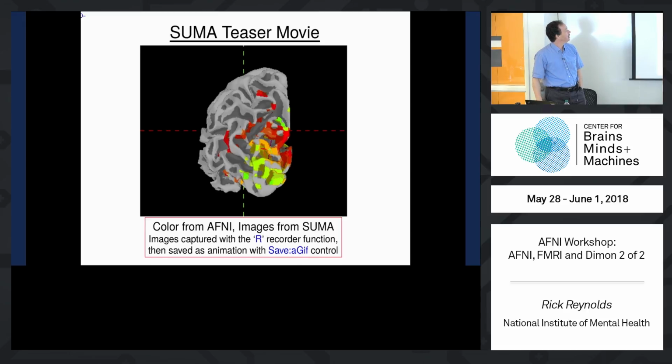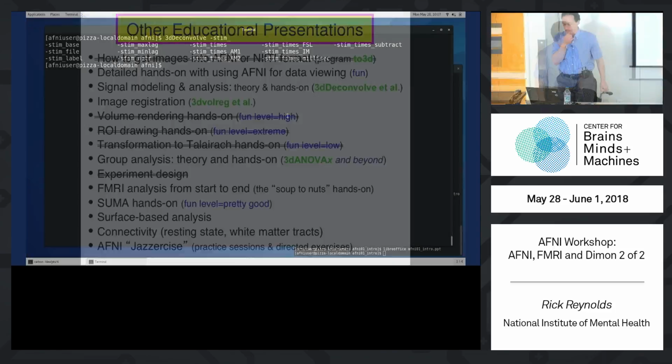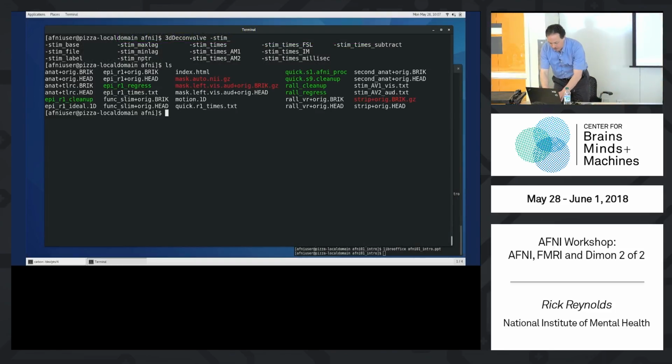SUMA teaser movie. This is especially a teaser because I can't show it to you. This is a PowerPoint presentation, and I'm using Linux, so I can't show everything right on here. I think that's enough for command line stuff in here too. Let me show you a couple more things before I move on to Dimon a little bit.